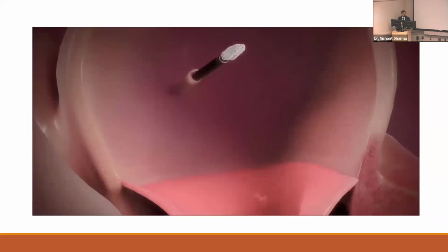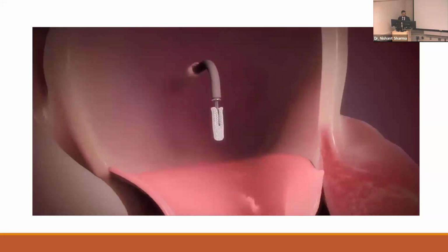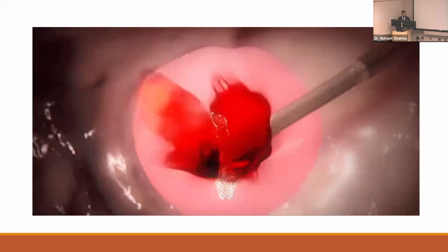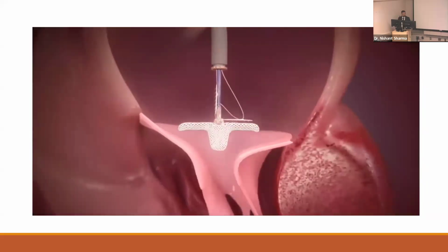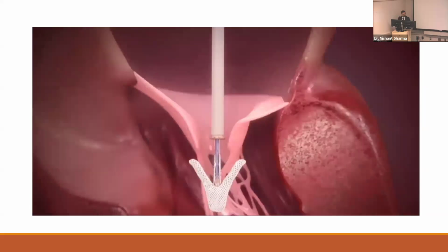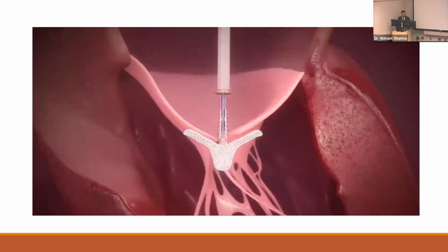The newer devices have the ability to monitor left atrial pressure throughout the whole procedure, which is really helpful. And then you introduce your clip, which angulates down towards the mitral valve annulus. A lot of your manipulations happen, or should happen, in the atria before you angle below the valve apparatus. Here you can see the clip arms are open. And then as you advance into the left ventricle, you adjust your clip orientation and trajectory accordingly, being sure that you're not buried in deep trabeculae or entrapped.